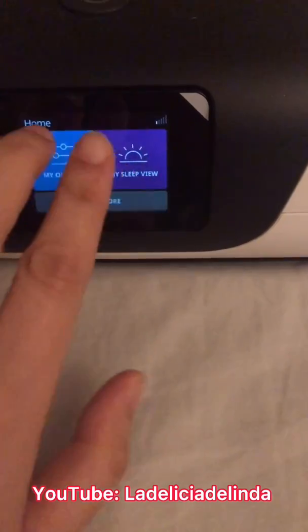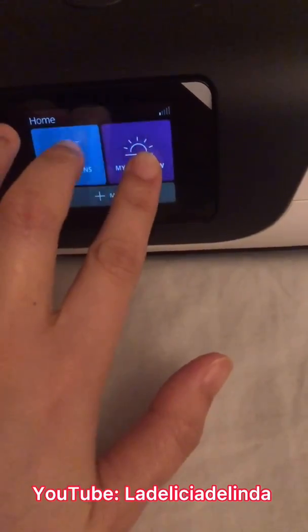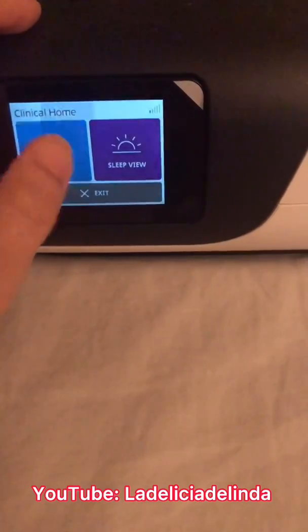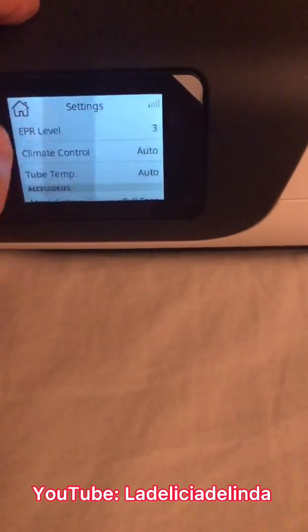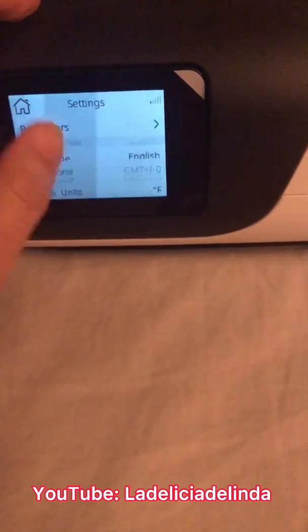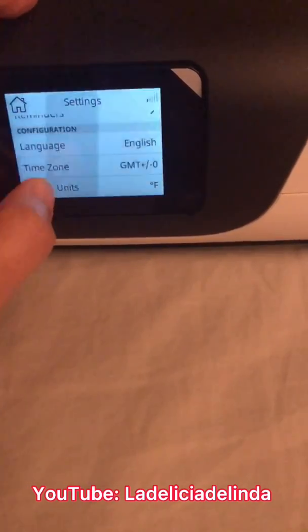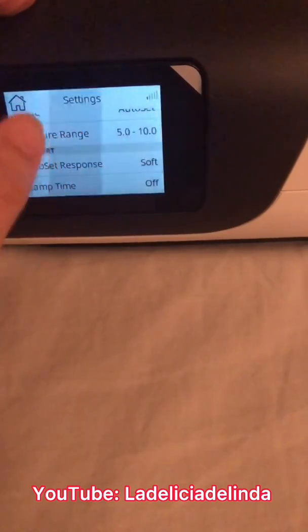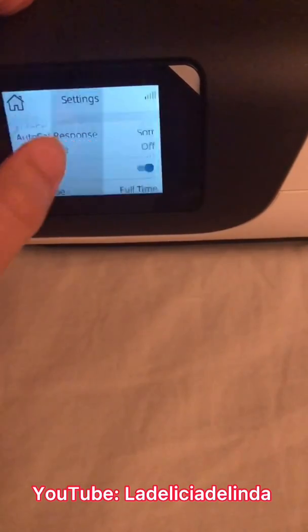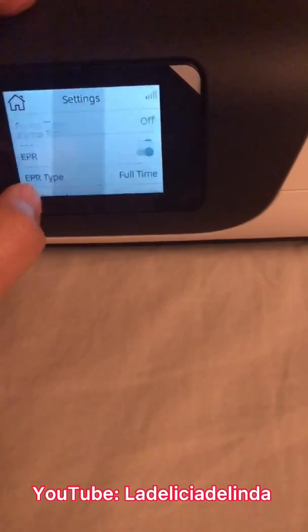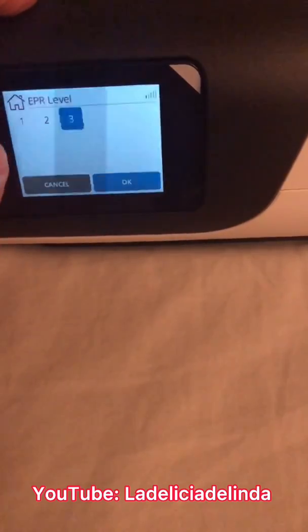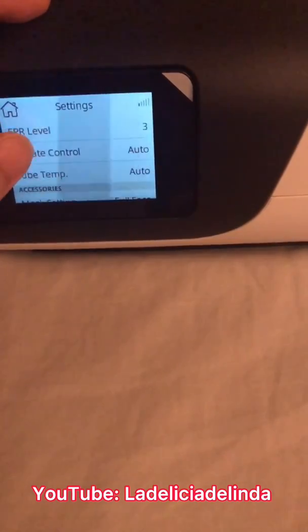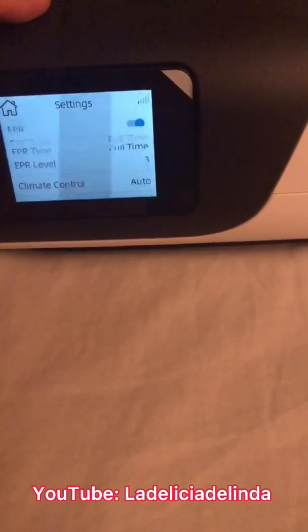Going back into the clinical home settings — these are the extra settings that the clinical side usually sees. It's not that much different, but there are some extras you can't adjust on your own. I like to set mine to EPR level 3 for maximum comfort when I exhale. EPR stands for Exhale Pressure Relief — correct me if I'm wrong — but basically it just makes breathing more natural and easier.